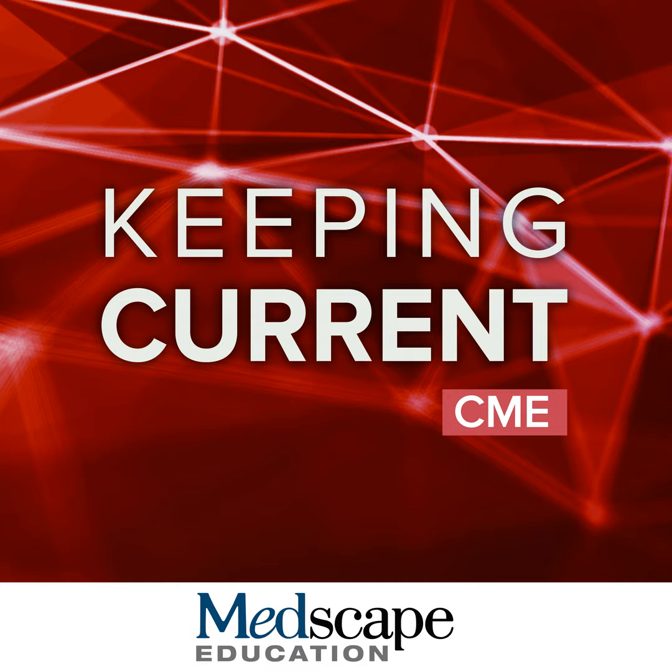So in my practice, at each of our sites, we try to have at least one 1.5T MRI scanner to be able to scan those patients who have relative contraindication to a 3T scan. And of course, we try to use the technology that we have available nowadays to make sure that the quality of the exam is comparable on the 1.5T and the 3T. And for most of the conditions, we can achieve that goal.